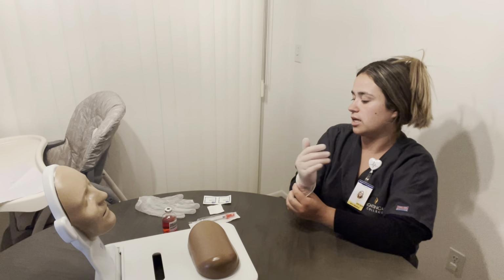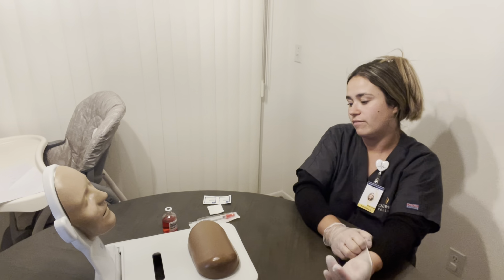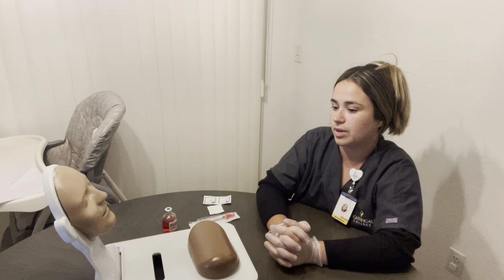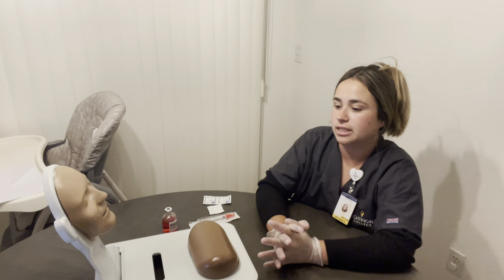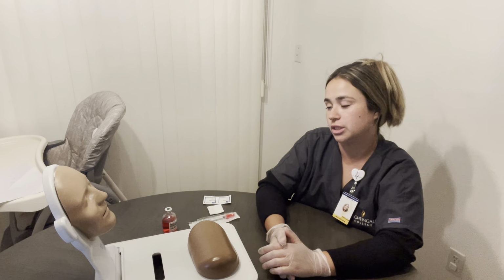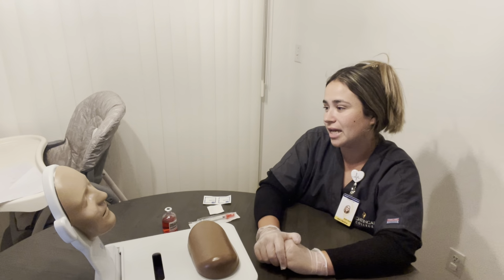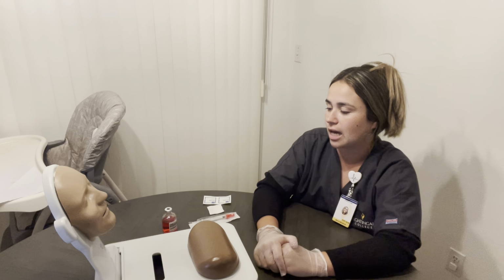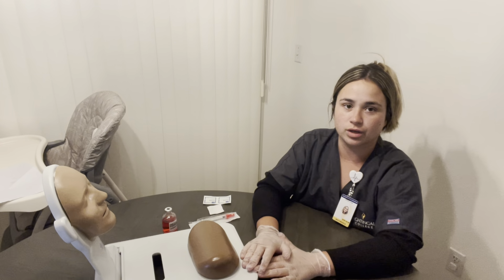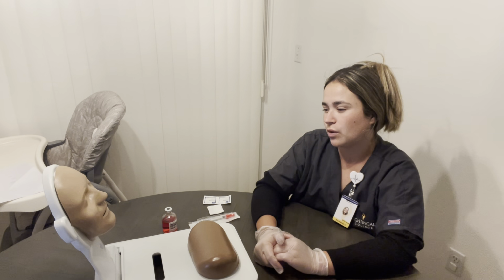So, Miss Smith, today the doctor has ordered a medication for you. I'm going to prepare everything so that we can do the injection. It's morphine sulfate. Basically, it's an opioid used for pain. Possible side effects could include nausea, vomiting, maybe headaches or burning or stinging at the location site of where we inject. There may be some adverse effects, which could be chest pain, respiratory distress, anything like that. We want you to let us know so that we can help you to the best of our ability. Now that I've gone over the medication with the patient, I would make sure that she doesn't have any questions. Ms. Smith, do you have any questions?